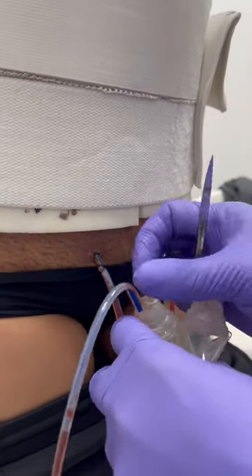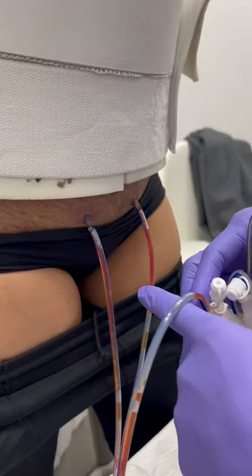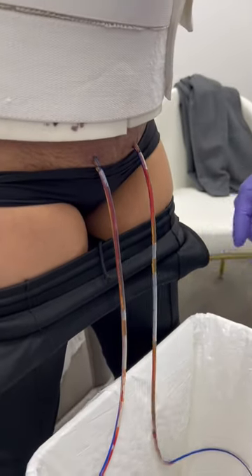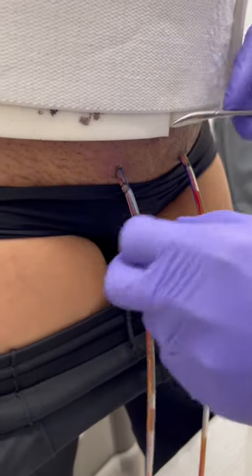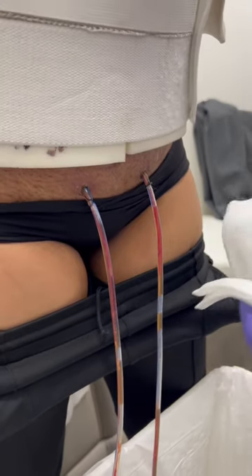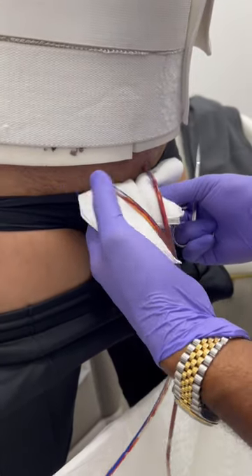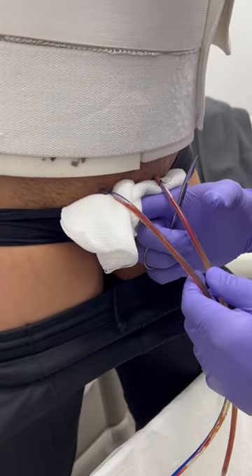The first thing we do is take the suction out of here and gently place it into the trash can. There's a little loop right there — we take that loop out, and the loop on this side. Nine out of ten times you don't feel anything as it comes out, and one out of ten times you may feel just a tug, but it doesn't usually hurt at all.